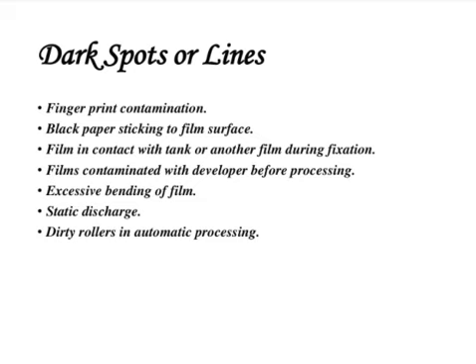Next is static discharge. When you open blankets, you will see some kind of current. It's called static discharge. It looks like a leafless tree, as if there are no leaves on a tree. That is how static discharge looks.